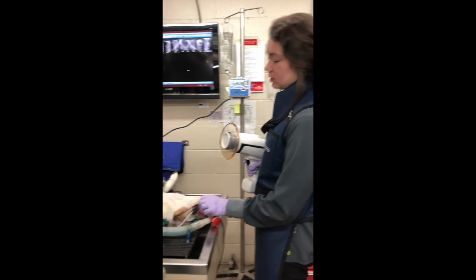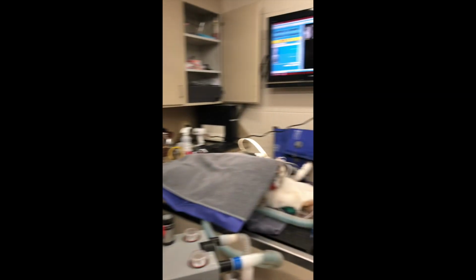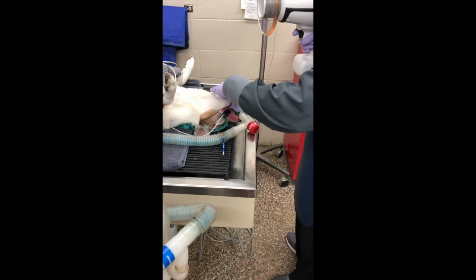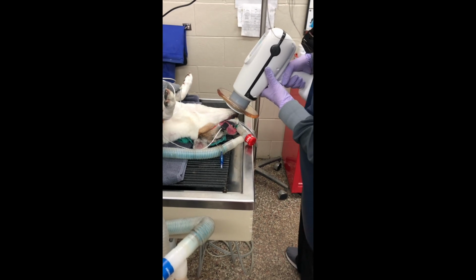Okay, I'm going to do 2 dental x-rays. I'm going to start with an x-ray of the bottom incisors. So I have my plate in there flat side up, and I'm going to go at a 90-degree angle with the plate.